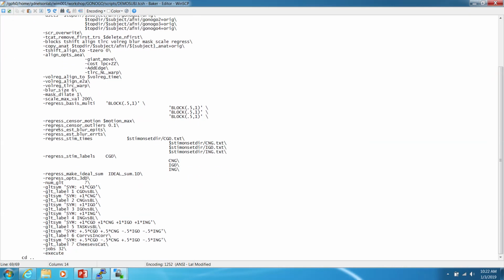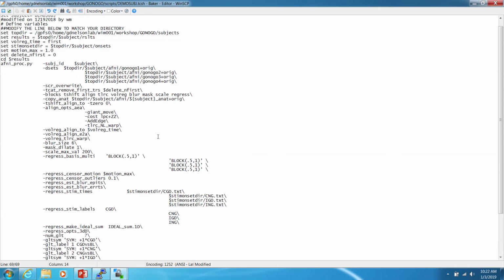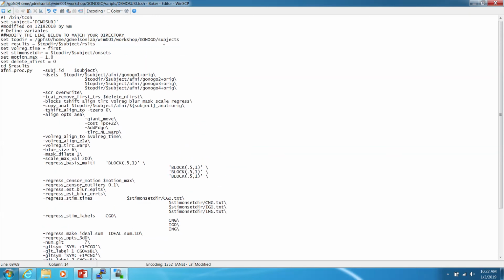Next time I'll go through what the output of that looks like, both in terms of what the script that comes out looks like, and also what the QC and results look like as it moves through the steps. I'll try to show you the images of each of these steps so you can see what this command actually ended up doing. So I'll leave that for the next session.